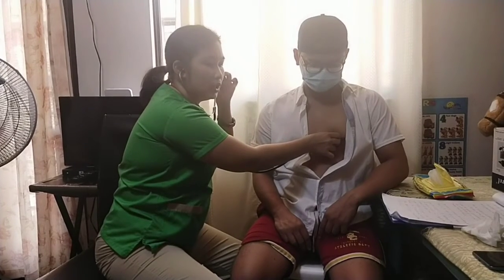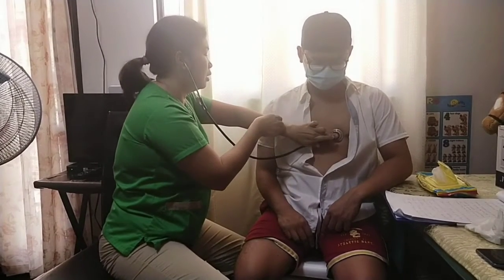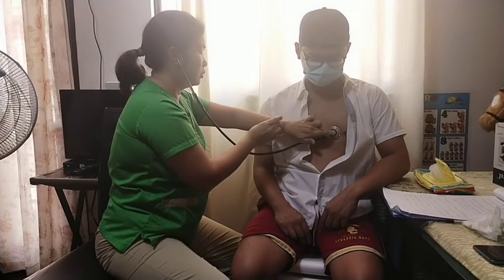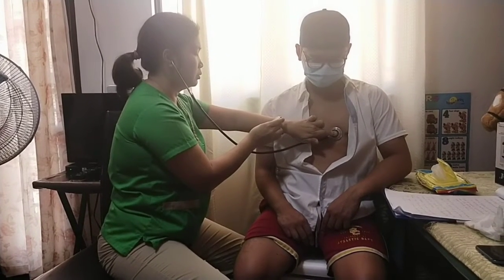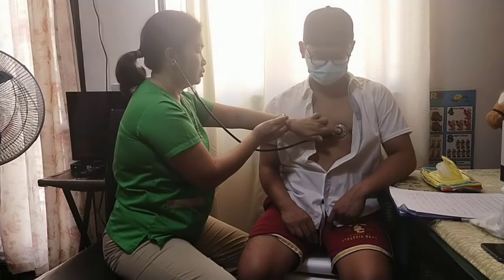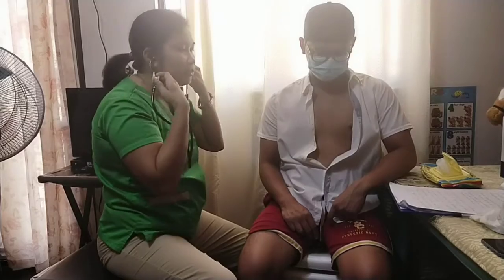If the rhythm is regular, count the heartbeat for 30 seconds and multiply by 2. If the rhythm is irregular, count the beats for 60 seconds.